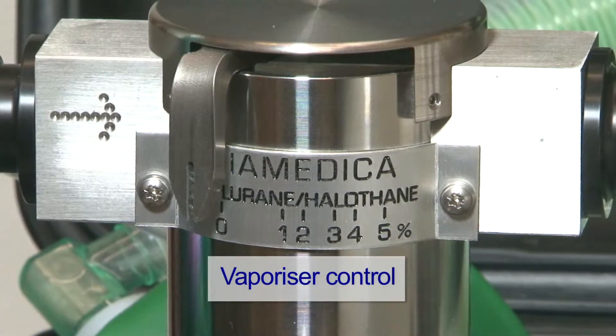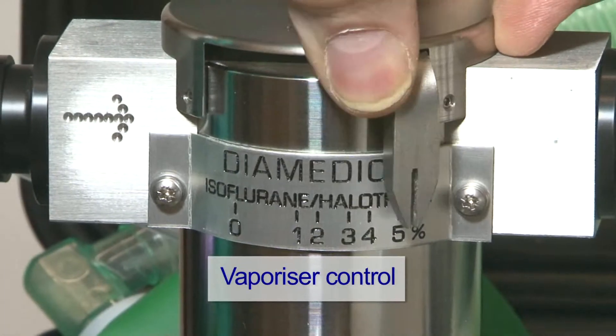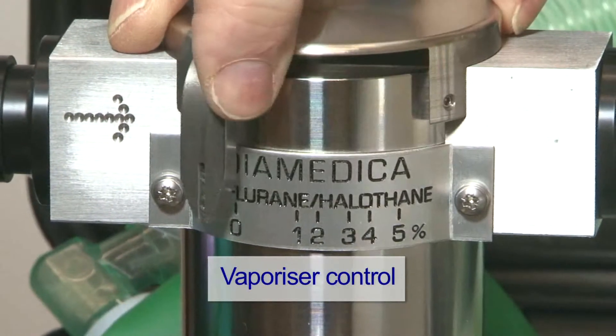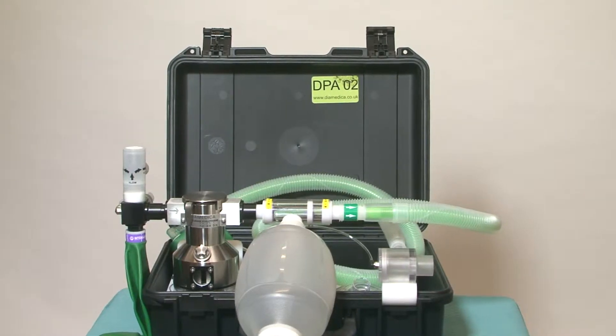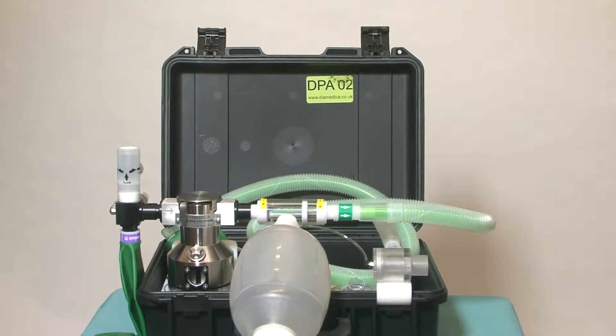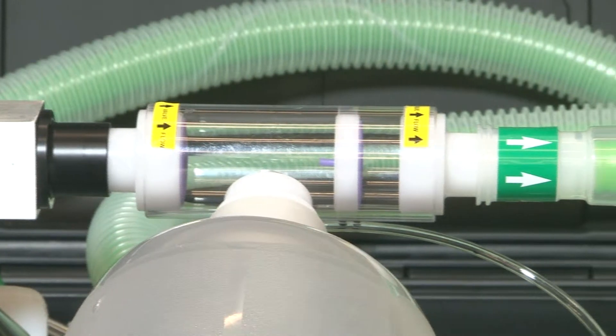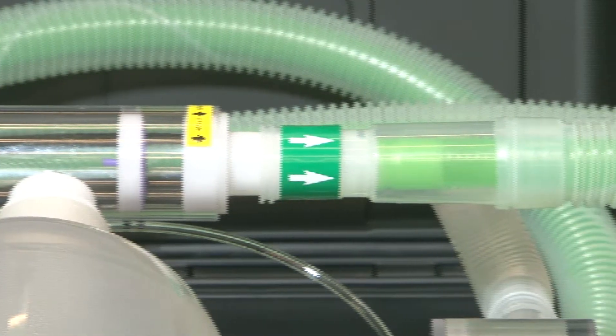The anesthetic agent output is controlled by moving the lever on the front of the vaporizer. The DPAO2 system is suitable for anesthetizing adult or pediatric spontaneously breathing patients, or with assisted manual ventilation.